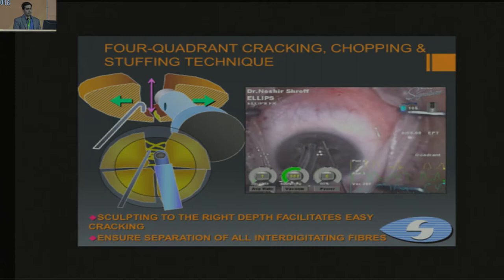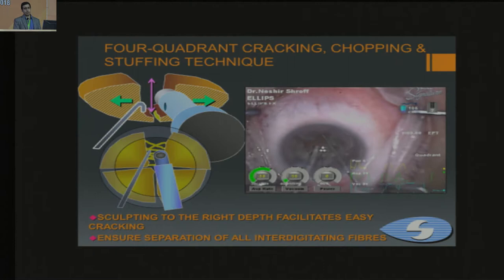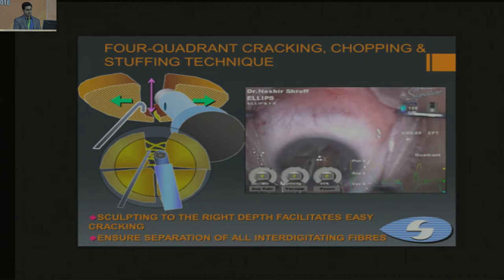This is the technique of actually cracking the nucleus — you can see it being separated into two parts, then rotated further to the other side, separating each quadrant to get four pyramid-shaped pieces. You hold each piece with the phaco probe and pull out each for emulsification.